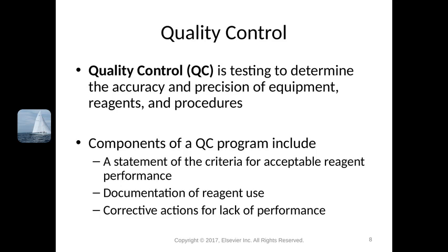Now, most of the computer systems nowadays have computer checks, or checks and balances, where you've got to stop. There's a hard stop. You can't go past it. You can't assign it. But the thing is, we still have to rely on our brains and our knowledge in downtimes, or in smaller hospital laboratories where they don't have a huge LIS.